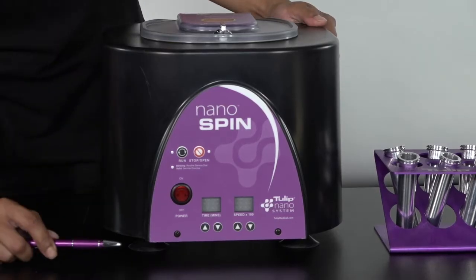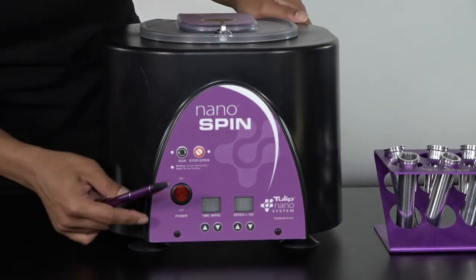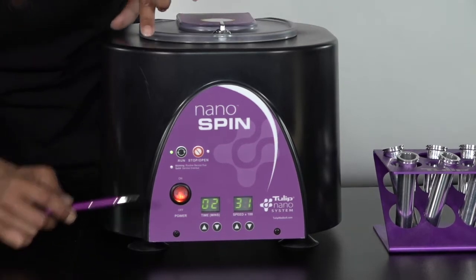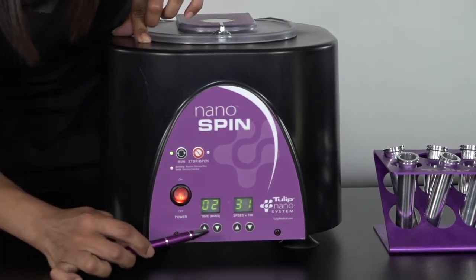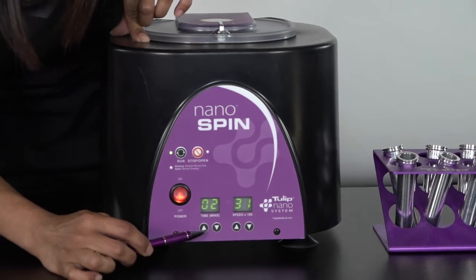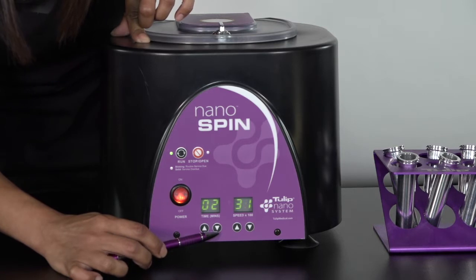I'm going to go over the front of the centrifuge. Here you have an on and off switch. To turn it on, simply lift up and you'll see the light come on. Here you have the run button and the stop button to run your centrifuge. Down here is the time in minutes. To adjust, simply push the up arrow to go up in minutes or the down arrow to go down in minutes.